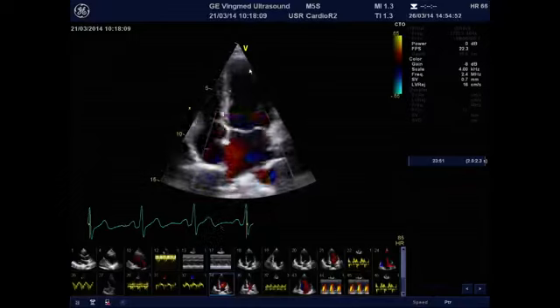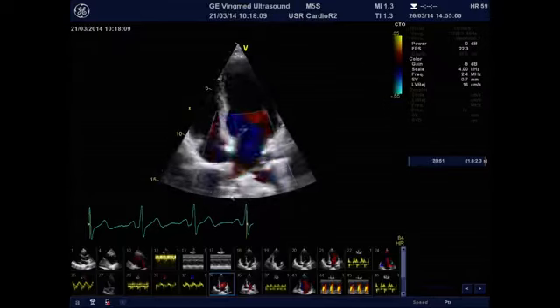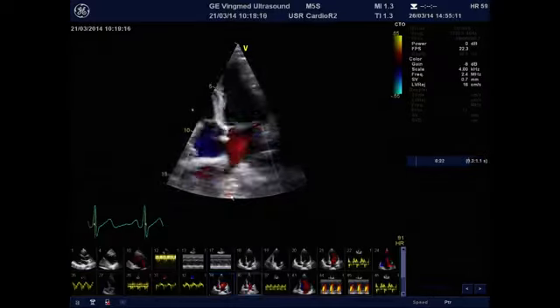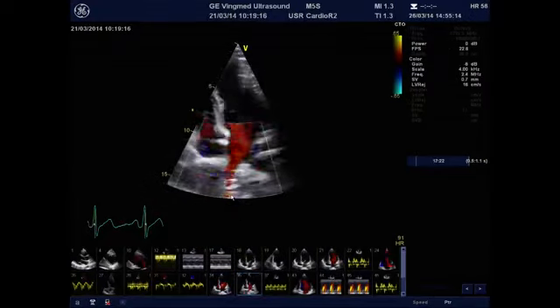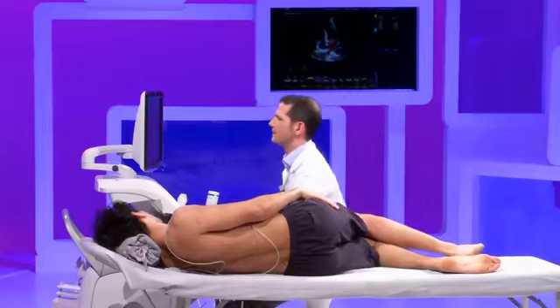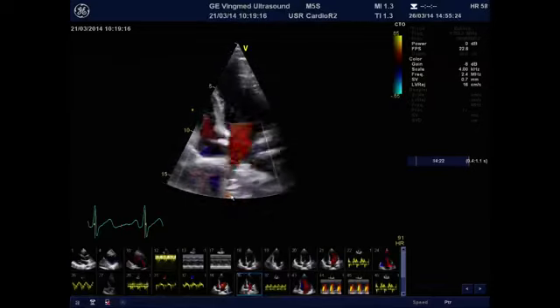For reasons of alignment, the best vein to use is the right upper pulmonary vein, which opens up next to the interatrial septum, and you can see it here. The trick is to always use, first of all, color Doppler in order to see it. Then, as I did, you can adjust a little bit your scanning plane by moving the transducer in a way that opens up the right upper pulmonary vein and really shows you nicely the flow, the blood flowing into the left atrium.